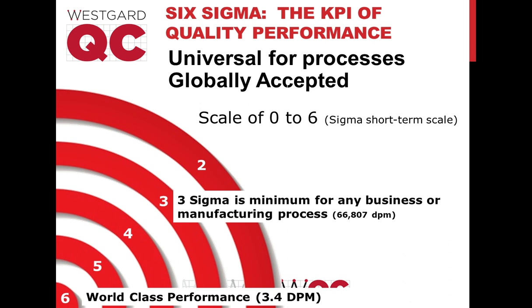Now, this question has a few parts. From a pragmatic point of view, how do we determine QC frequency? When the QC material covers all reportables, there is a variable range of quality in each channel, which means a decision is needed. Do we set QC frequency to the bad baso number channel or the stable RBC channel? With a wide range of total error for something like the monos, does it really matter?